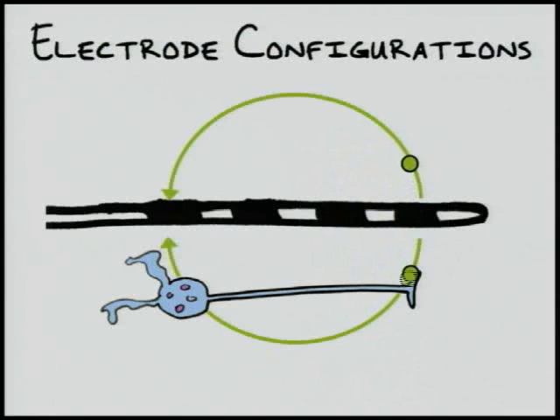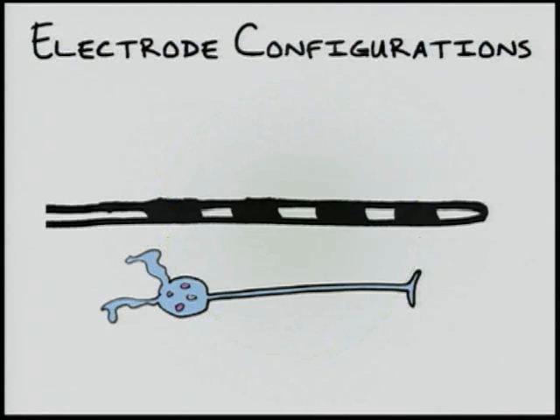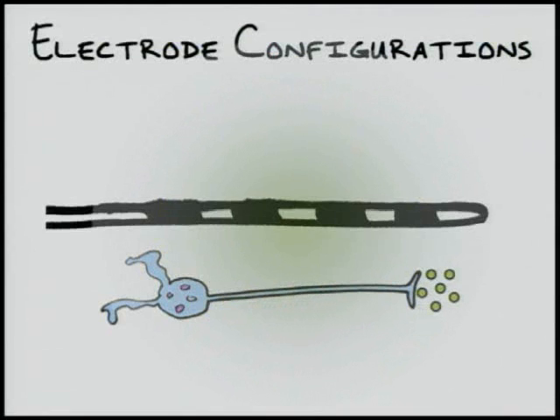Selecting a pair of electrodes with greater spacing will produce a larger area of stimulation, exciting neurons farther away from the lead. However, it should be kept in mind that this increased electrode spacing produces less precise areas of excitation, possibly making stimulation less specific by activating not only the target nerves, but also other nearby neurons.